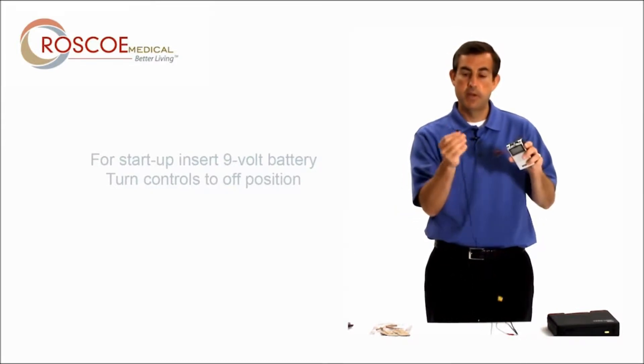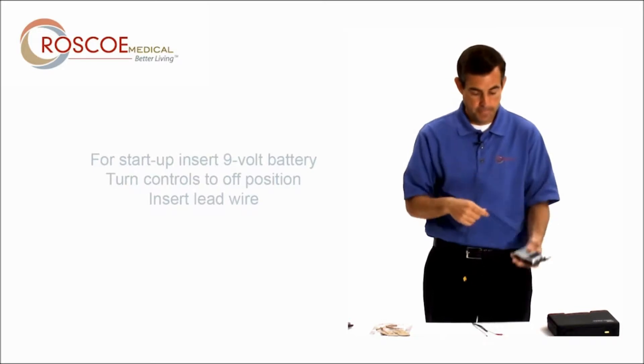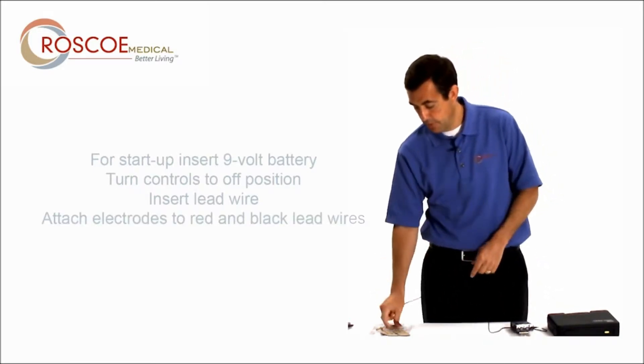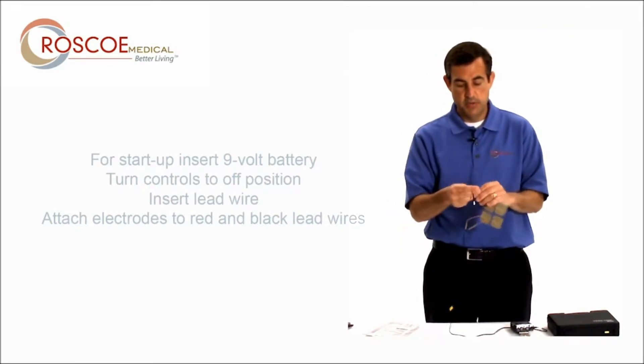Today I'm just going to do a two-electrode setup. I'm going to take the lead wire and put it right on top and insert it into what we call the channel. Then I'm going to insert the red and the black tip of the lead wire right into the electrode.